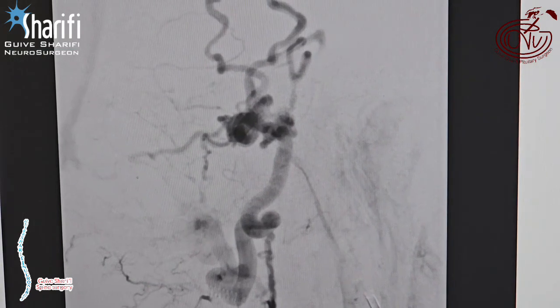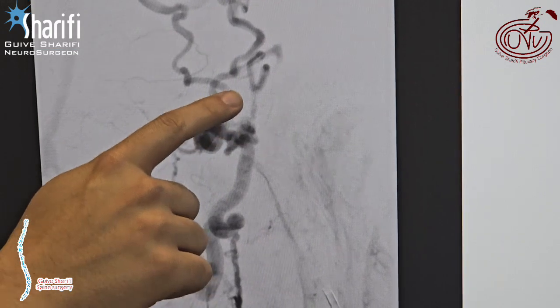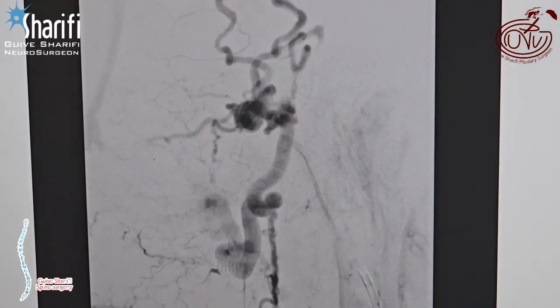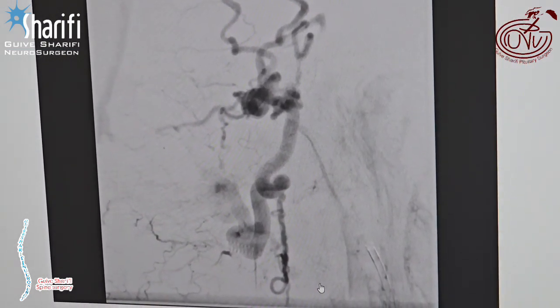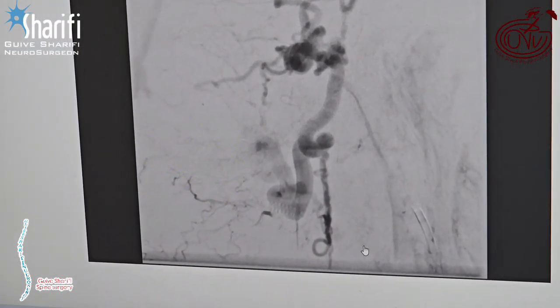Their drainage was both anterograde and retrograde. This is very important because it has reflux into cortical veins, which shows it is a very high-grade dural fistula, and it is very prone to both ischemic and hemorrhagic complications. Therefore, these kinds of fistula with cortical drainage are the most dangerous ones. The cortical drainage happens through the retrograde filling of the cortical veins.